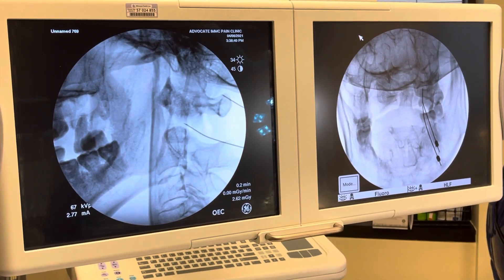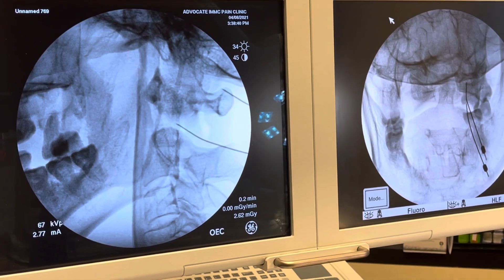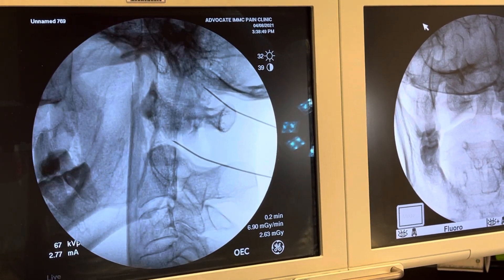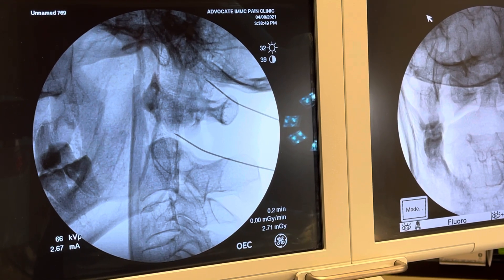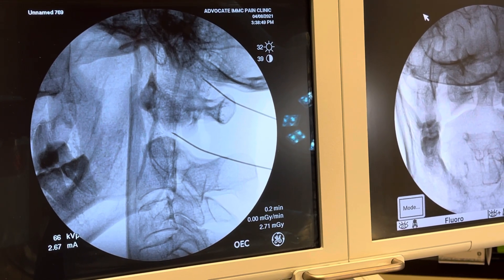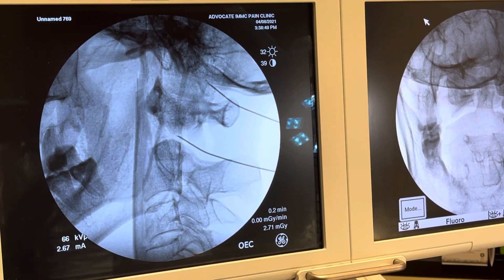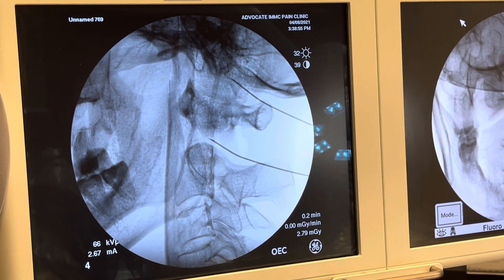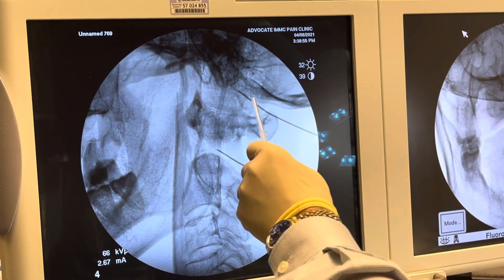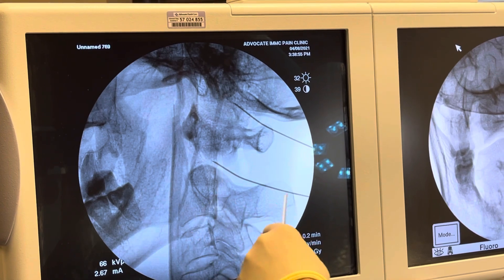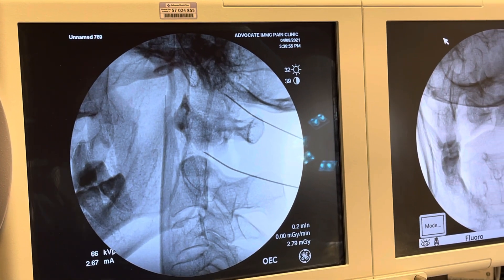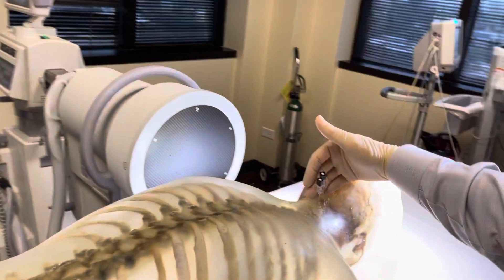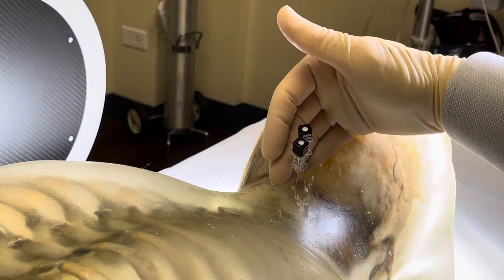I now advance my needle somewhat more anteriorly. There — I have just about entered, and I feel a pop in the specimen. I am now in the atlanto-occipital joint and in the atlanto-axial joint — two joint injections performed. You can see how the needles line up with each other, pretty much parallel like a picket fence: the two needles for the atlanto-occipital and the atlanto-axial joint injections.